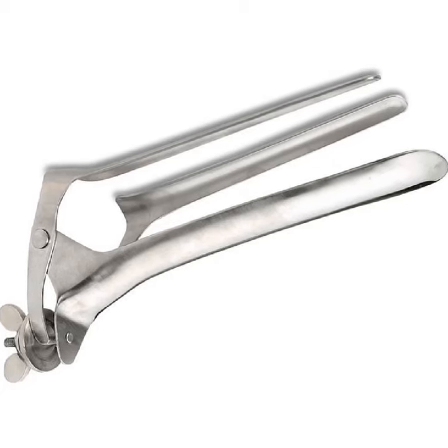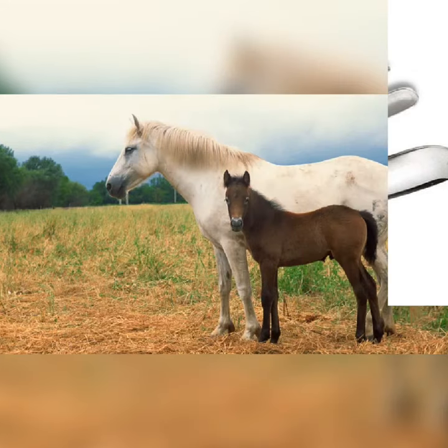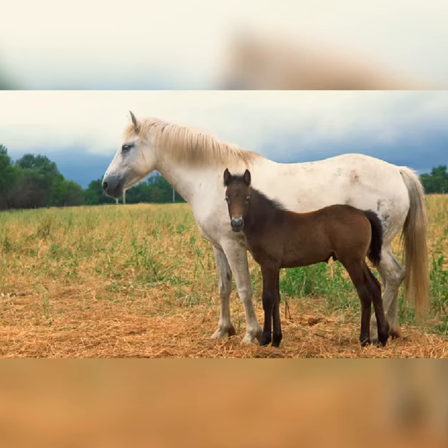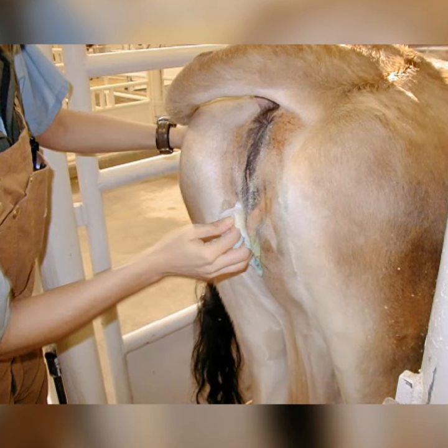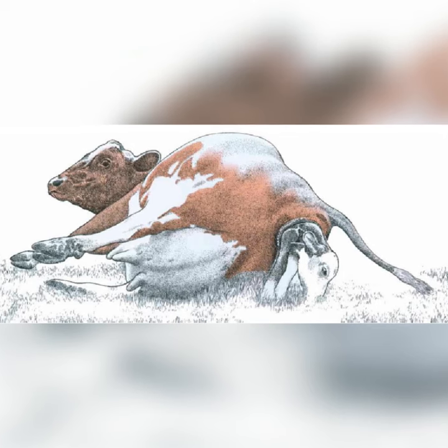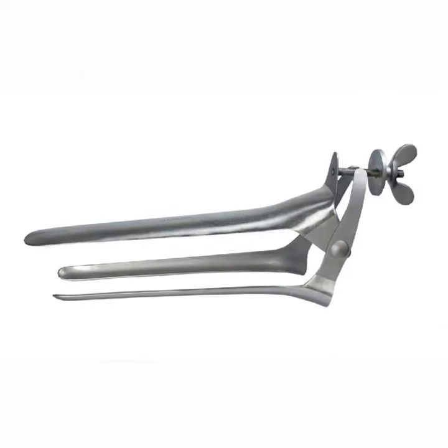The Polanski vaginal speculum is designed for large animals. It is used for diagnostic examinations and other medical procedures. It holds the labia open so the vaginal vault can be viewed for swab taking or direct medication to the uterus. It can also be used during the urinary catheterization of a female cow or mare.